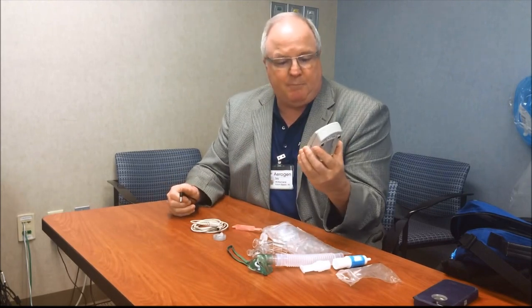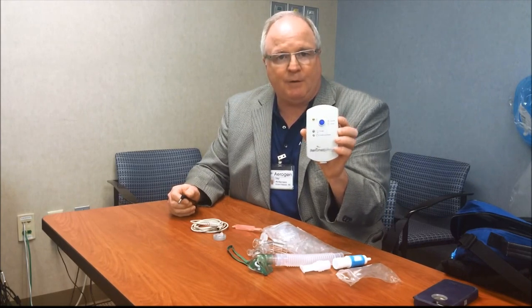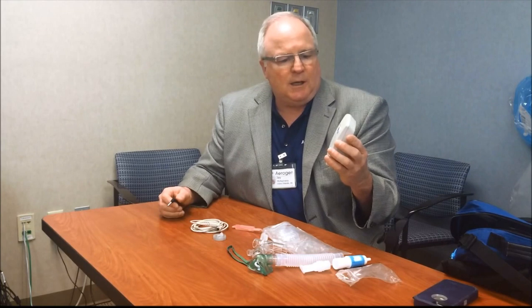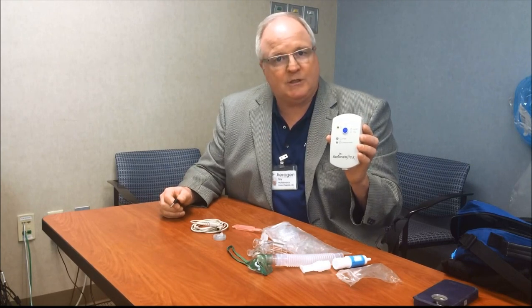It's marked Aeroneb Pro X. You'll see it has a blue on-off switch on it. There's two options with the on-off. You can go to a 30-minute timed mode, in which case it will turn off on its own after 30 minutes. And you also have the continuous mode, which you achieve by depressing the blue button for 4 seconds, and it will go to the continuous mode.